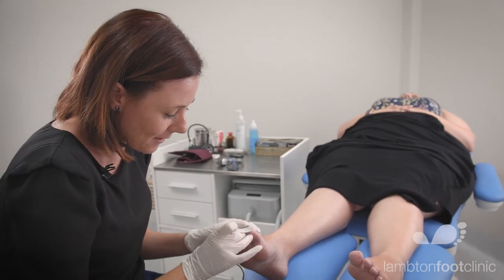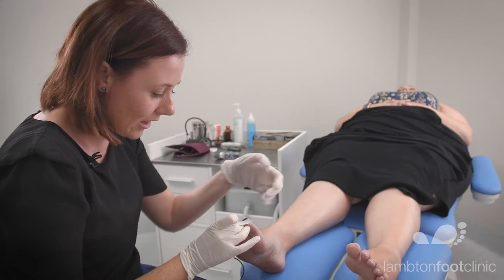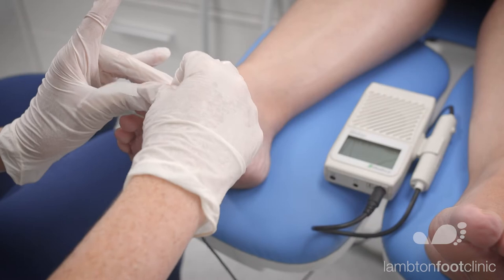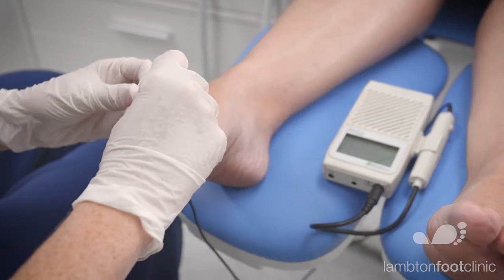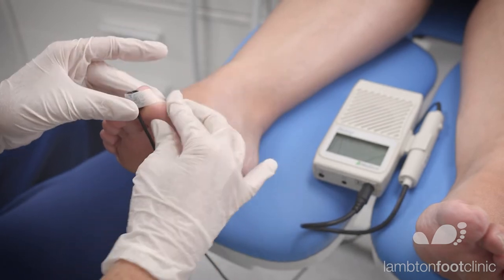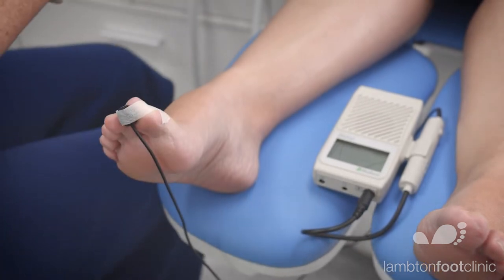So if I was to place it up here, that would not be ideal because light can enter. So it needs to be nice and flush. We use a piece of micropore or other tape just to tape it in place, like so. So it should be fairly well sturdy and taped.